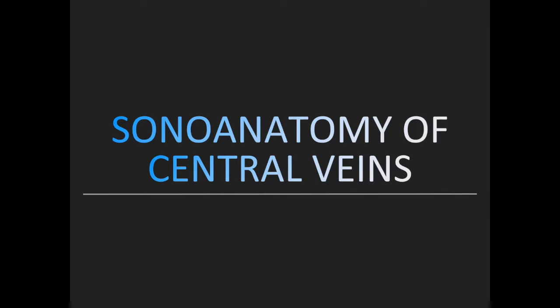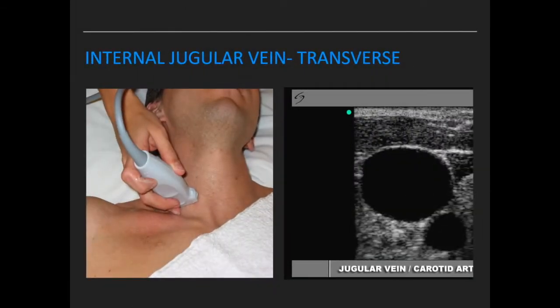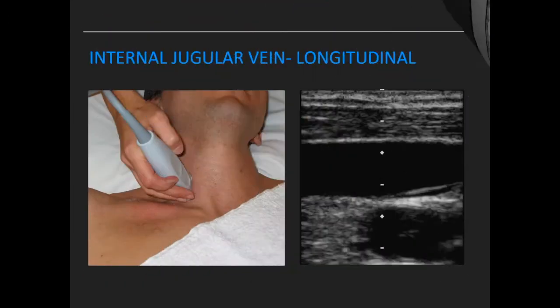Coming to sonoanatomy of central veins: the transducer used to visualize vessels is the high-frequency linear transducer. On transverse view, the IJV sits lateral to the carotid artery. On longitudinal view, the IJV remains parallel to the carotid artery.